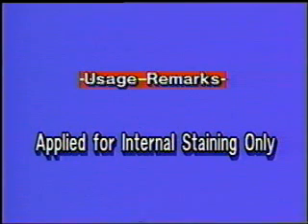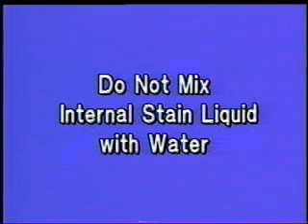Now we have a few words about the application of internal live stain. Internal live stain is specially prepared in accordance with internal stain technique. Please note that it can be used only as internal stain. Do not mix internal stain liquid with water because of its indissolubility. Remove the stain adhered on the brush with tissue paper.